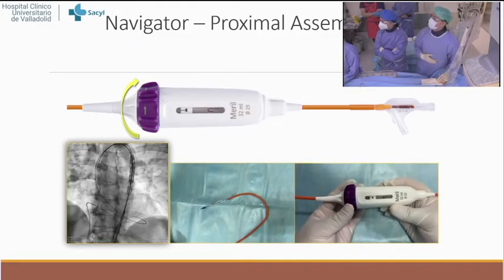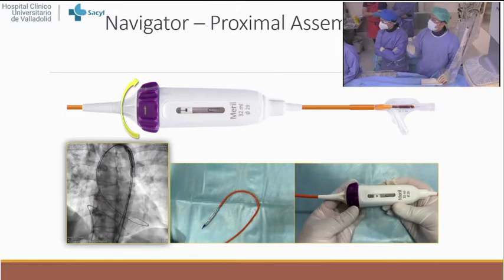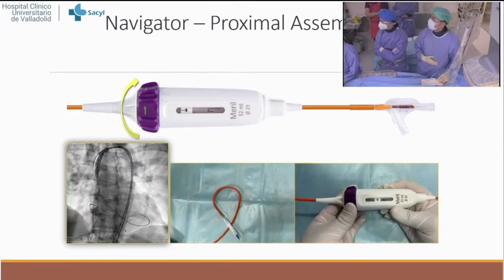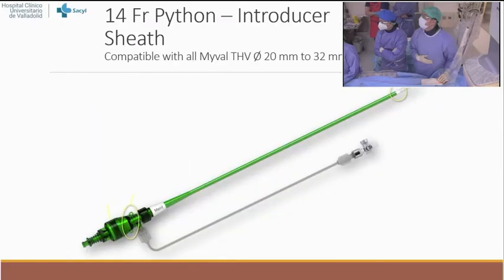This is the Navigator system. The valve is directly crimped on the balloon, and as you can see, it's a very flexible delivery system. Next slide. And this is the Python introducer that we don't have yet in position, and we will show it. It's an expandable 14 French introducer that is the same one for all sizes, from 20 to 32 millimeters. Next slide.